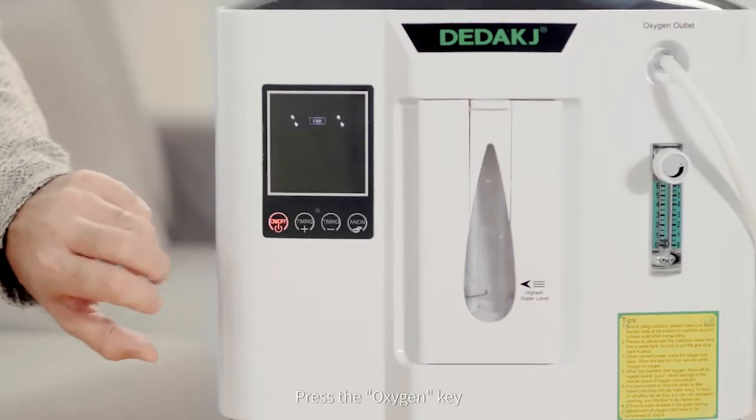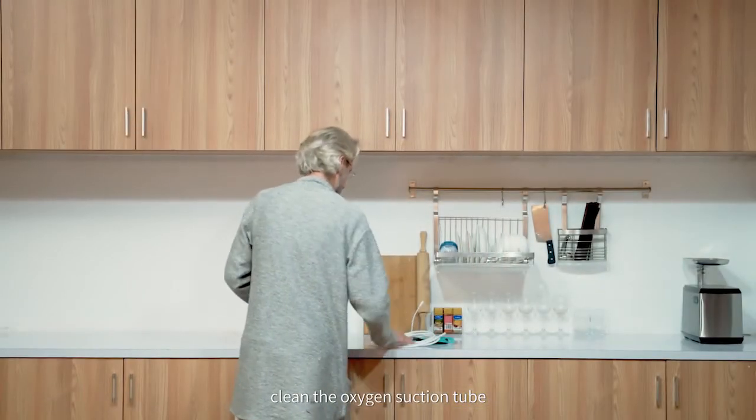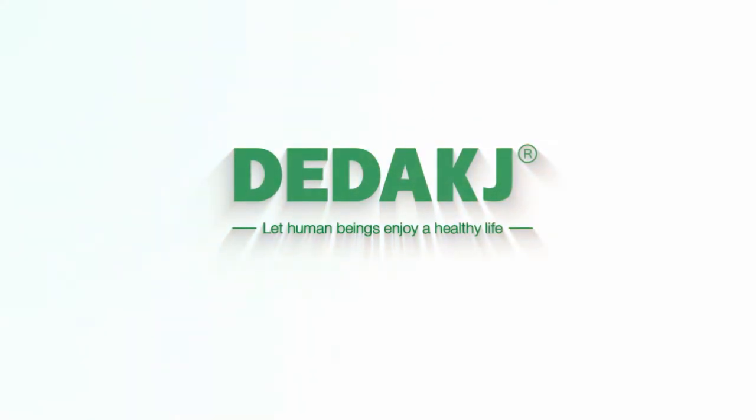Press the oxygen key to stop oxygen making. Then turn off the power switch. Clean the oxygen suction tube to prevent dust, and store it properly for next use.